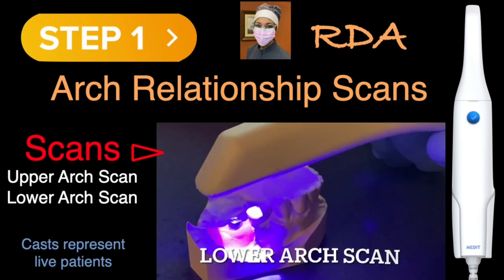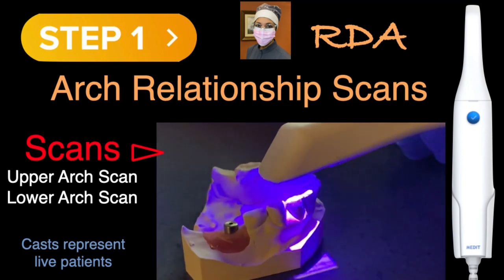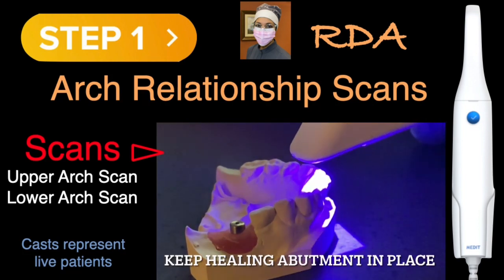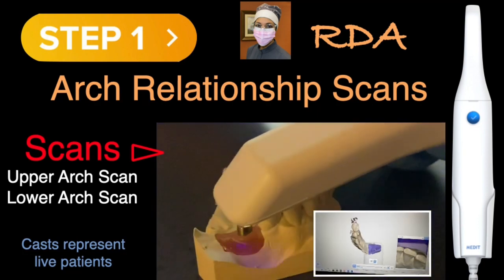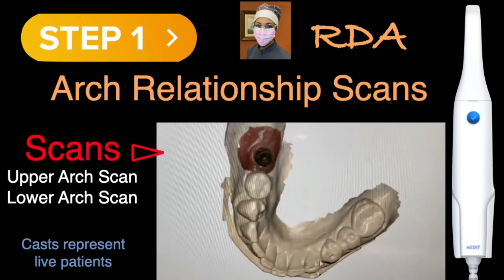As we start the lower, we know that the healing abutment is still in place. That is intentional. We want to leave the healing abutment there so that the soft tissues are not going to slump. So the dentist is also required to take this off. As the dental assistant goes around, they can do the things that they need to do prior to the dentist coming into the room.